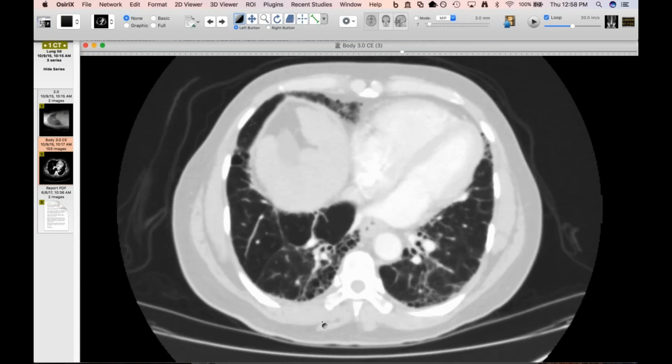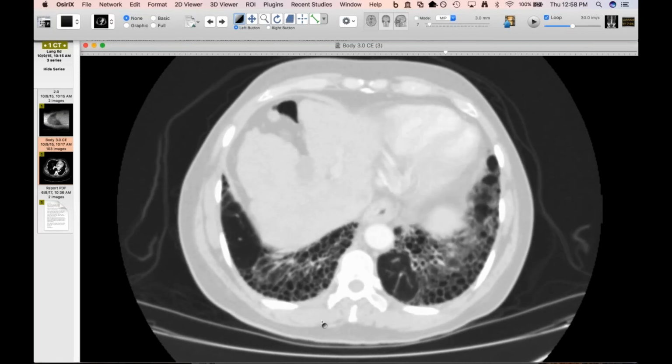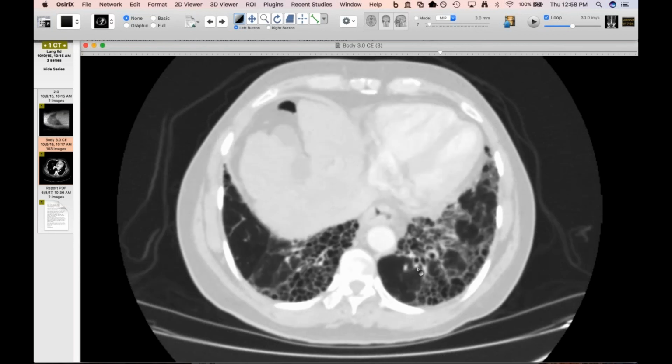It would be very interesting to see what the pathologist says, because so often what they call honeycombing isn't what we call honeycombing, as we know. And it would be interesting to see if the microscopic features they see are consistent with UIP in their book. I would have called this personally.